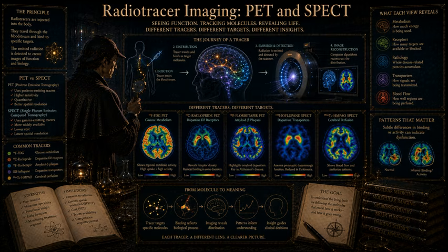We do this using scintillating crystals. Scintillating meaning they literally flash with light. Exactly. The detector rings are lined with thousands of dense inorganic crystals. Materials like bismuth germanate, or BGO, and more modern iterations like lutetium oxyorthosilicate, LSO. Quite the mouthful. Very much so. These materials are incredibly dense. When a 511 keV photon slams into one of these crystals, it is abruptly stopped. Its kinetic energy is absorbed by the crystal lattice, and a portion of that energy is immediately re-emitted as a tiny flash of lower energy photons, essentially visible or ultraviolet light.